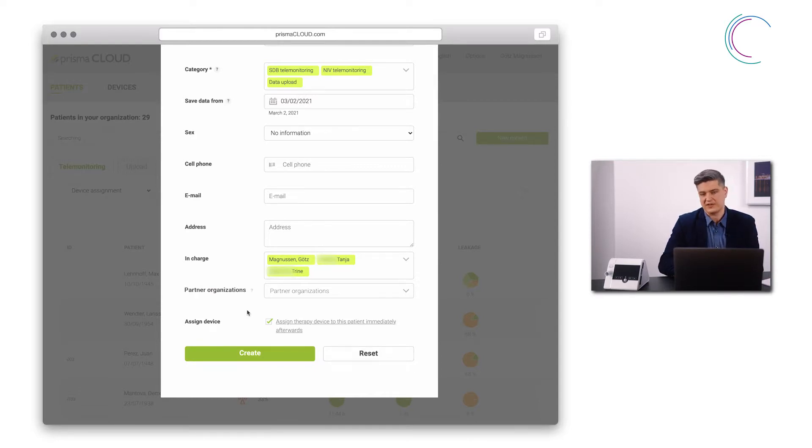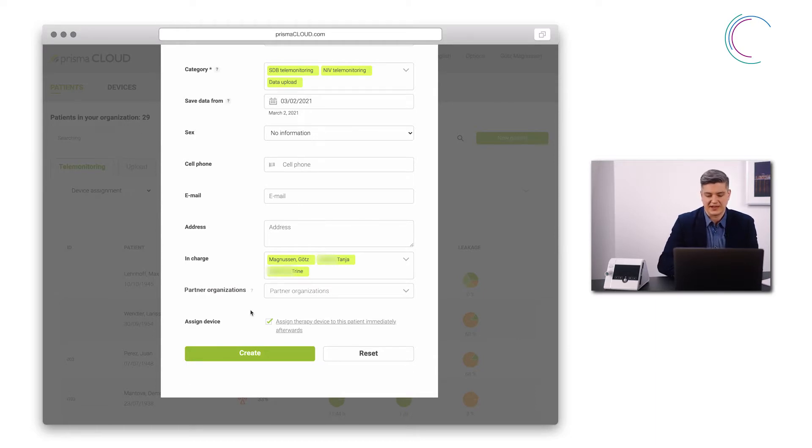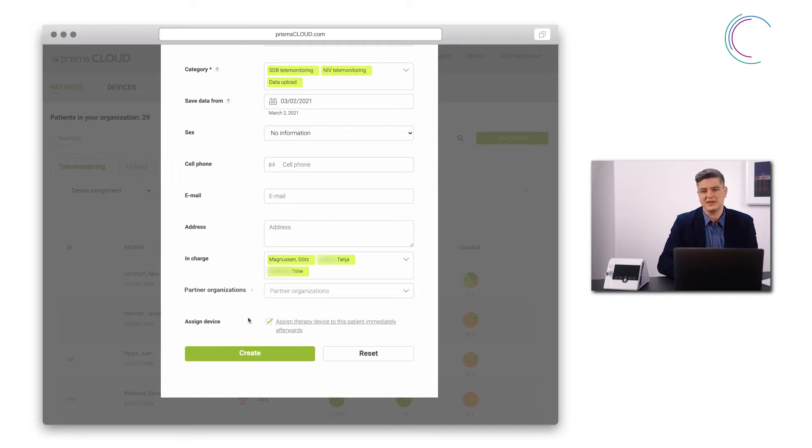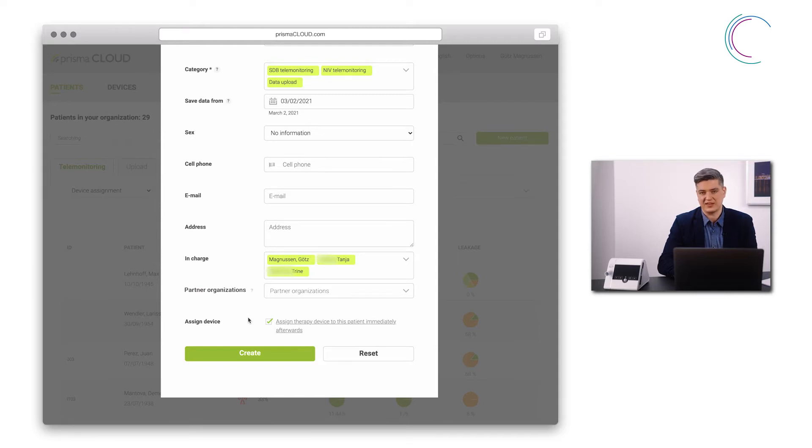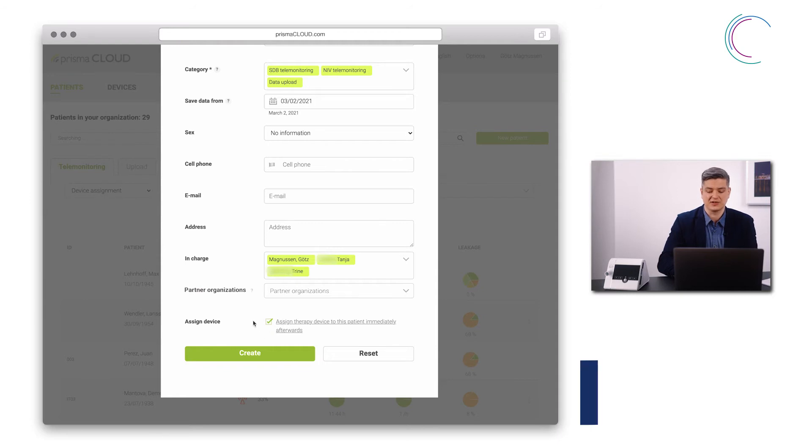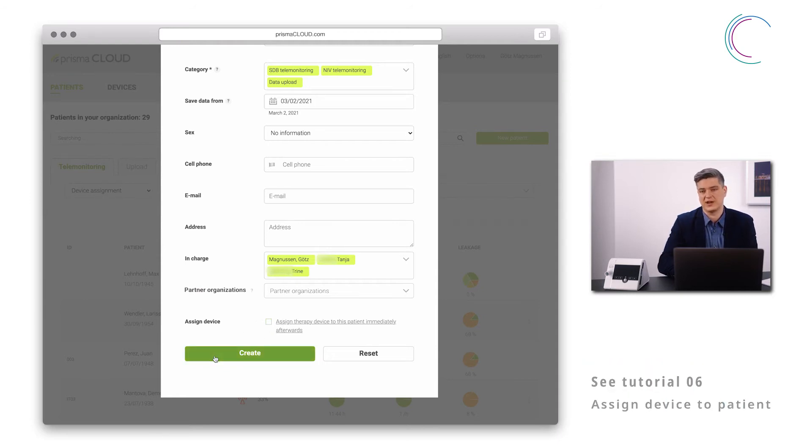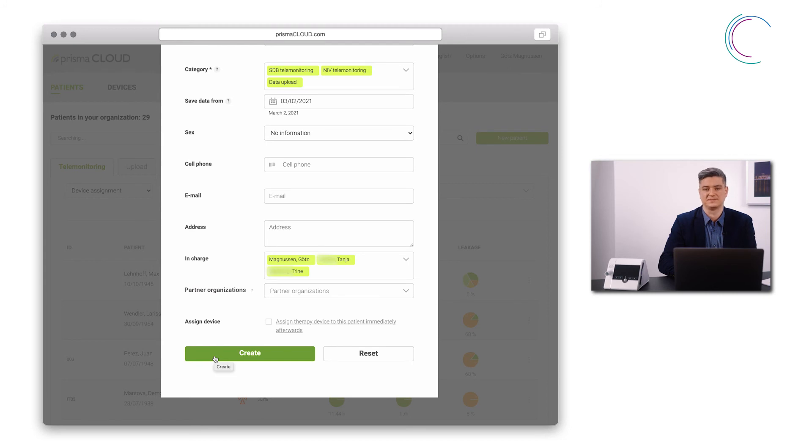If my therapy device is already connected with Prisma Cloud I can leave this option here checked. This will open up a list of all therapy devices that are already connected to Prisma Cloud but not associated with a patient. I can then select the device of the patient and assign it to them. If it's not connected I can uncheck this here, click create and the patient is then created.